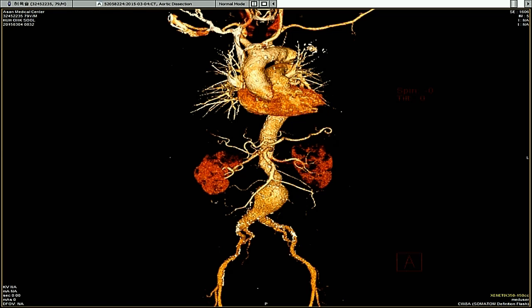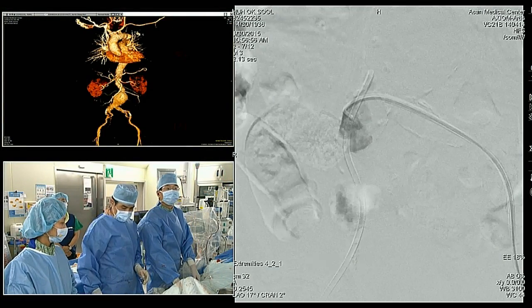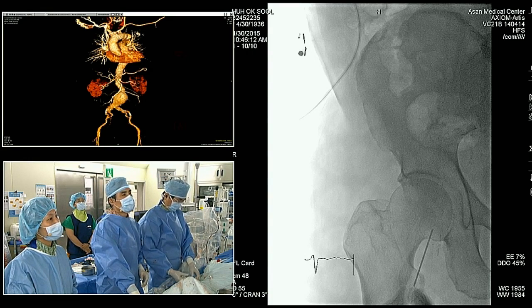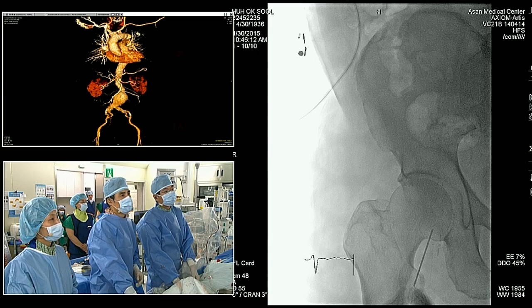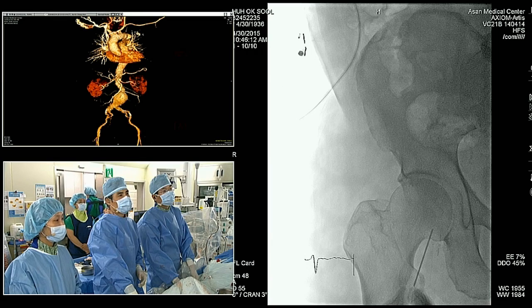Yes, okay, so is there any comment or suggestion? So if I understand you correctly, you have ectasia of the common iliac arteries, but dimensions are within the realm of that treatable with endografts. We have only the 3D MIPS reconstruction here. On the axial images, is there a significant amount of surrounding thrombus or not in the iliacs?